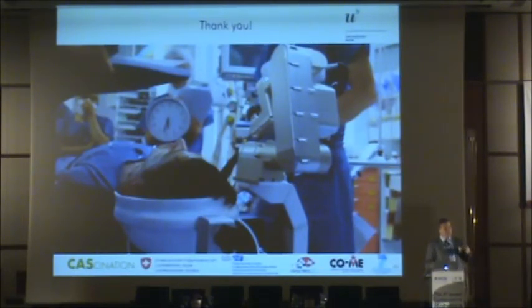But if you're able to put implant electrodes into the cochlea that stay and that go in, and you preserve the residual hearing, then this is a big boost. So we are not there yet. This is a step that comes into the future. This is really where we have the hope, because we can do process control.